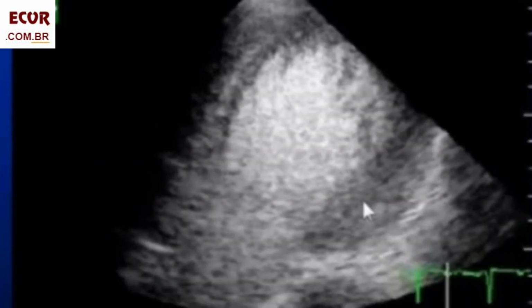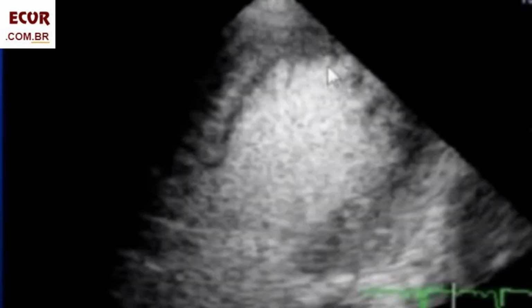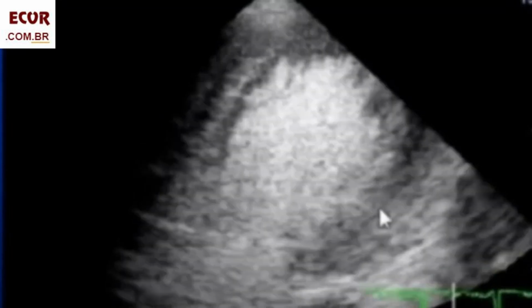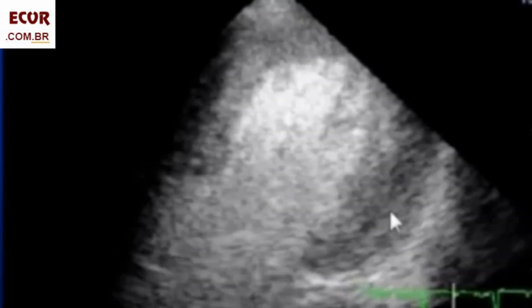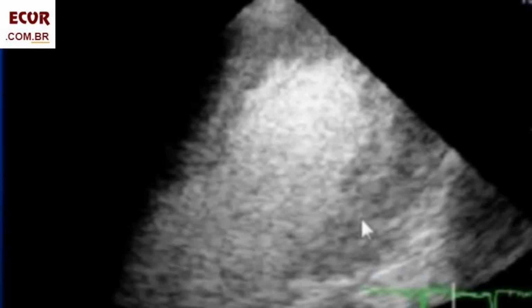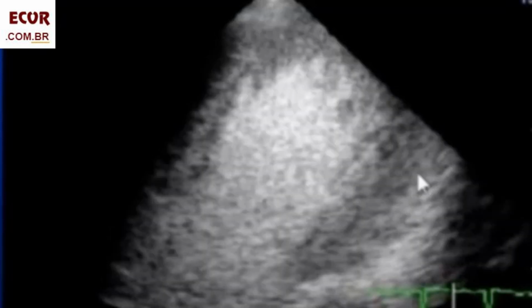Look at this case. Pay attention to the left ventricle lateral wall. This is an off-axis four chambers view. IVS, apex, and lateral wall. At rest, there is perfusion here at the lateral wall and at the IVS, since they are not black. Microbubbles are in these walls at rest. Then we inject IV adenosine and watch what happens.